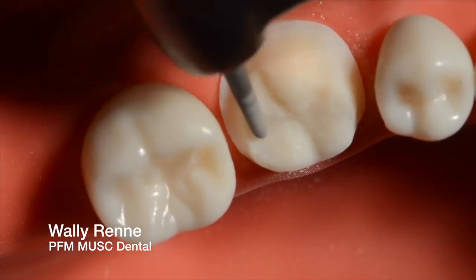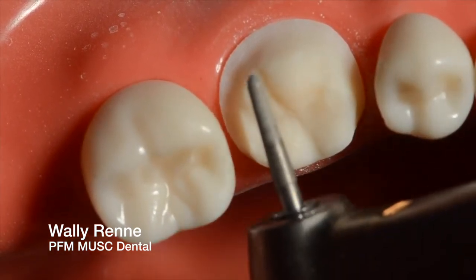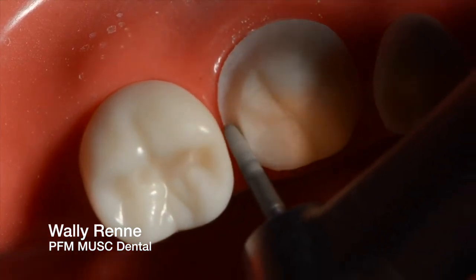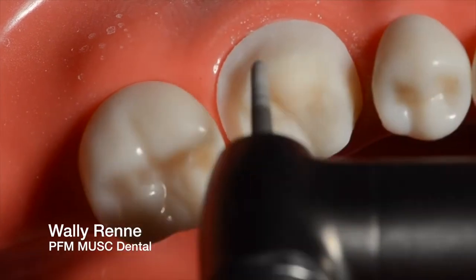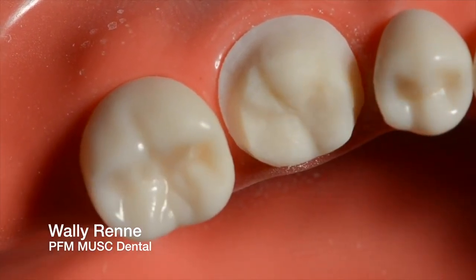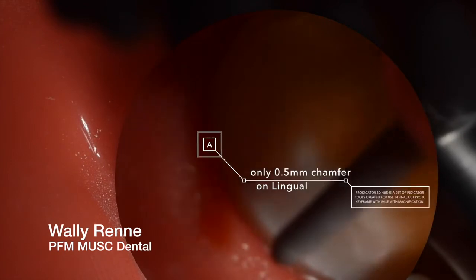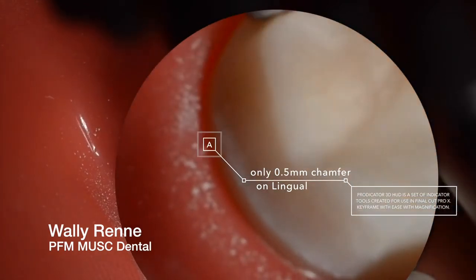Now after we finish smoothing the occlusal, making sure there are no weird lumps that don't belong and no sharp little grooves, we're going to accentuate that finish line and smooth it out. Make sure it's uniform in thickness — one millimeter on the facial all the way through the interproximal until about right there, then transition to a light finish line, about a half a millimeter gold margin. With the 016, this is the light chamfer — no more than a half a millimeter — and it just blends right into that heavy chamfer. That's it. I hope this helps a little bit with something that's hard to understand. If you have any questions, just email me and I'll be glad to sit down with you one on one.